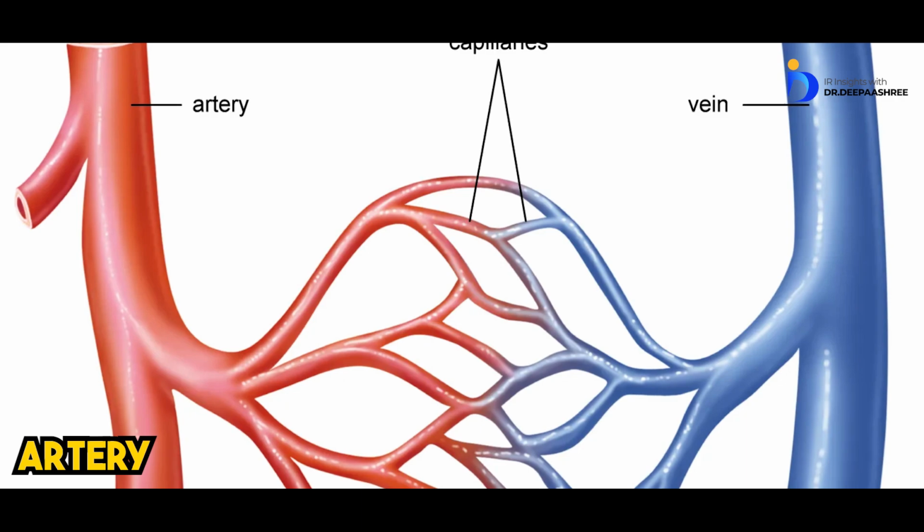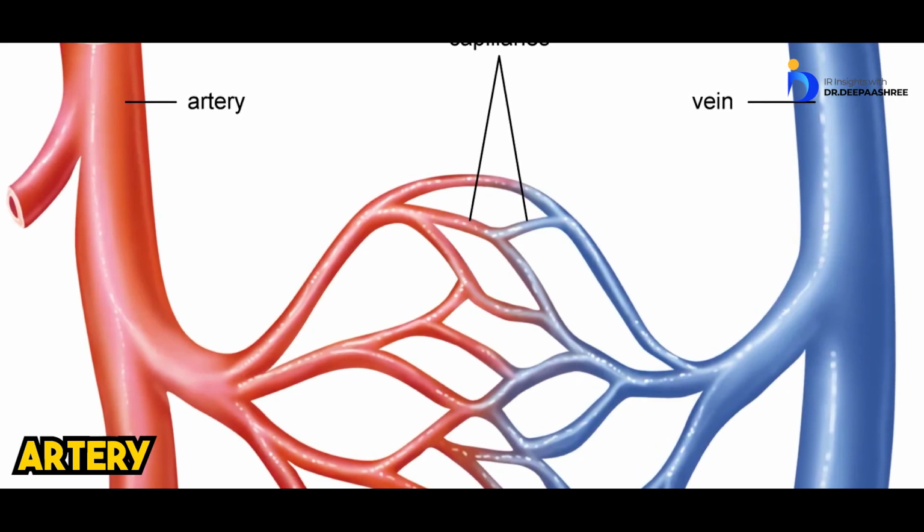In a splenic artery, hepatic artery and all, I think that depends on the size of the artery. What's the difference between the artery and the vein? See, artery does not have the ability to expand. But vein can have more space, and you can even stuff an 8 millimeter or 10 millimeter coil in a 6 millimeter diameter portal vein because the wall doesn't have all the 3 layers. The wall you can expand a little bit more.